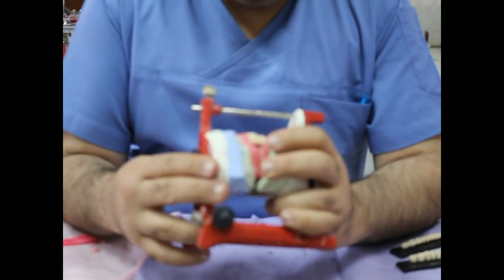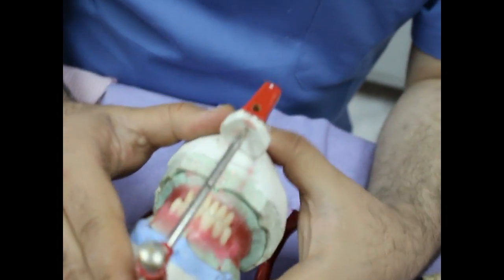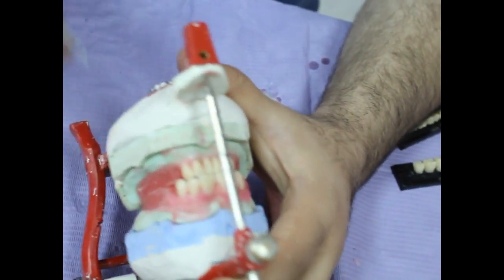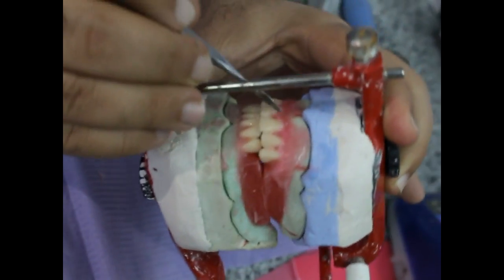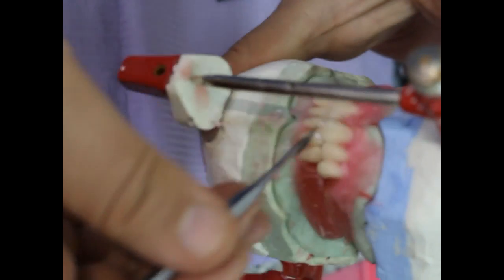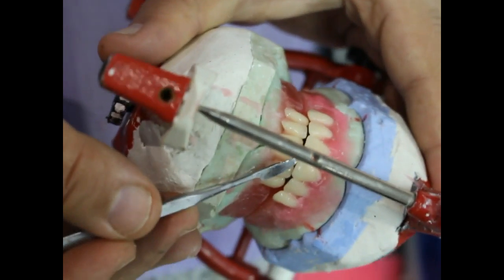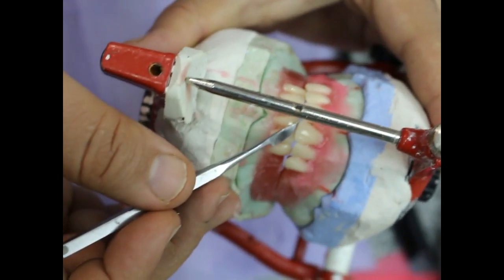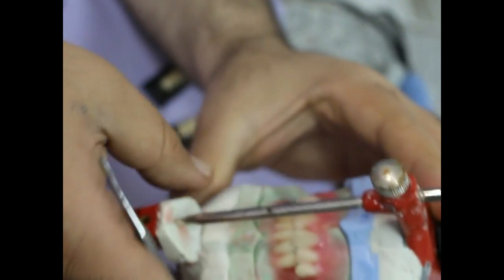We have finished anterior artificial teeth setup. We have a common central line between upper and lower artificial teeth. The incisal edges of our anterior teeth are covering the incisal edges of lower anterior teeth. The amount of horizontal overjet is nearly equal to the amount of vertical overlap. The horizontal is slightly larger to maintain stability.